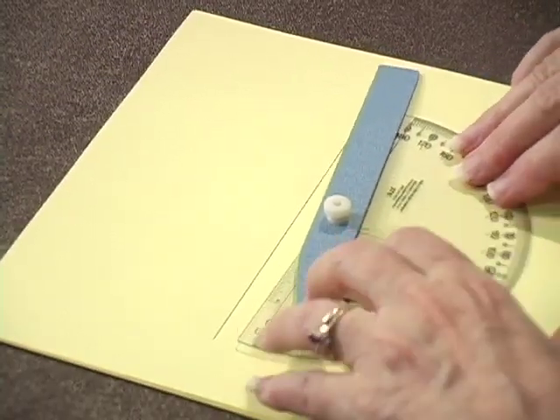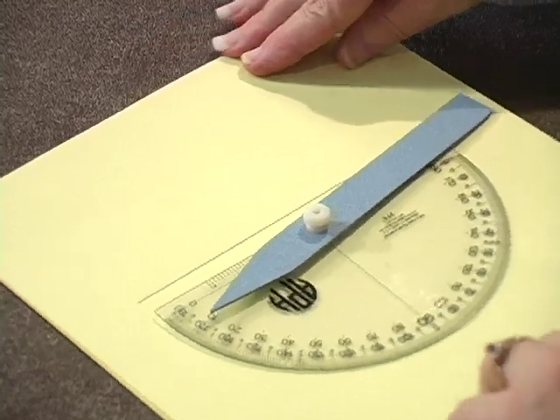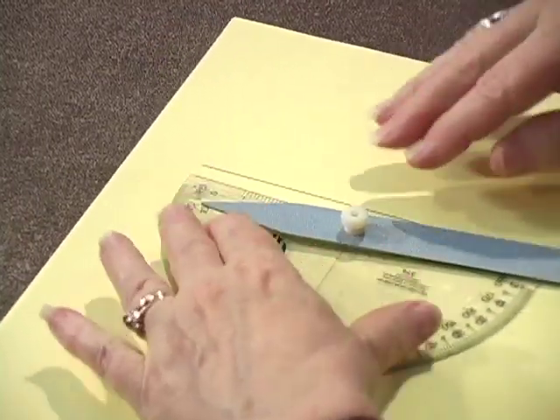First thing we're going to have to do is find ourselves a straight edge. Now this just happens to be a real ruler, and notice I'm even putting it upside down. I'm not even looking. I am just going to use it to draw, I was about to say straight line, but I should say line segment. So I'm going to draw something just relatively straight, okay? Now, I am going to use my vision in this particular case because I'm not going to be able to feel the line I just drew. So, in fact, I'm going to go ahead and move the paper this way so I can see better.